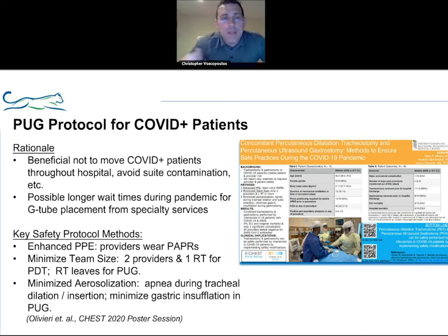And so in this current age, I'd be remiss if I didn't mention something directly related to COVID-19. This has really consumed our life now, going on for the second year in the critical care world. But you can see the overwhelming benefit of this particular technique, to where if patients at your institution needed to be transported, say to the endoscopic suite or to interventional radiology, and they're COVID-19 positive, well, that is a risk that you would rather not take in transporting that patient. They're better off staying in their negative isolation room. Well, here with the PUG technique, they can stay in their negative isolation room, and you can simply do this procedure at the bedside.